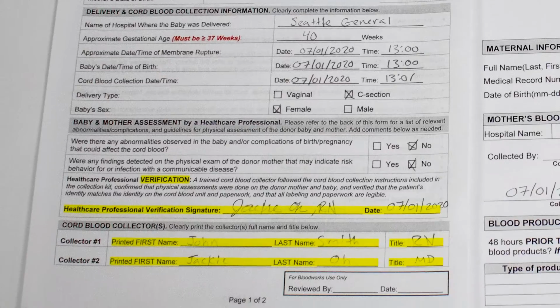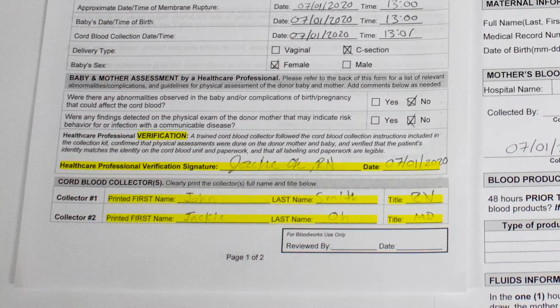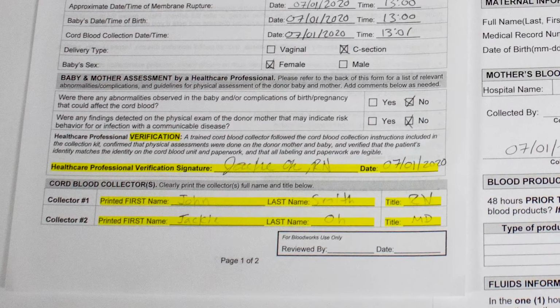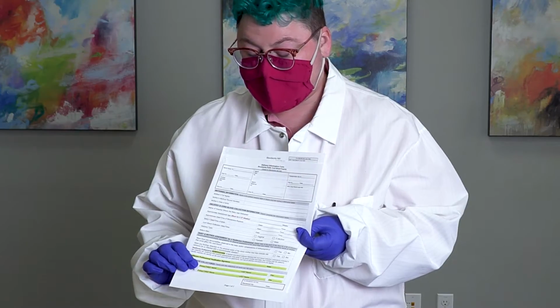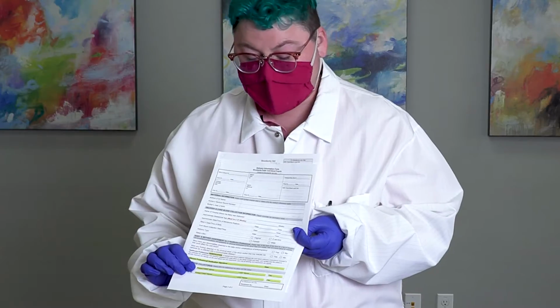At the very bottom of this form, there's a cord blood collectors line, and we currently have a collector line for 2 cord blood collectors. At least one of these collectors has to have completed the annual certification within the last 12 months. Please ensure that a trained cord blood collector's name is included here and that they are involved in the collection.